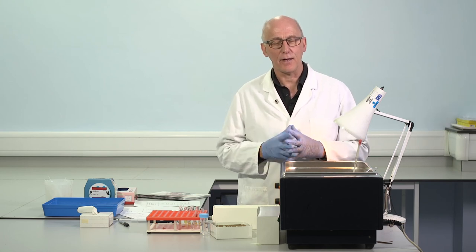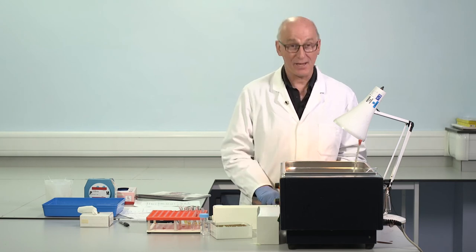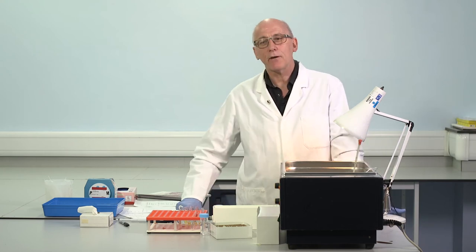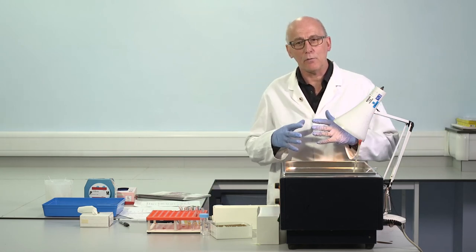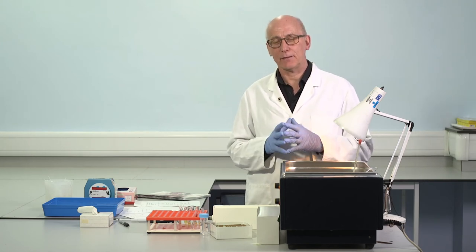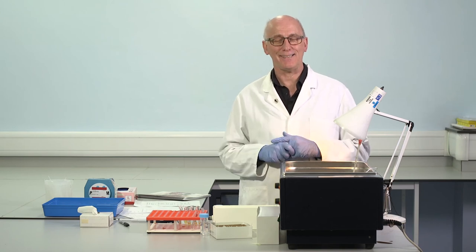And that's a fairly typical finding. So we've got a dilemma in the lab when we are thinking about which APTT reagent to use whilst we're running this correction. If we choose a reagent which has a very high phospholipid concentration, then we will less frequently detect lupus anticoagulant. If we use a very low phospholipid concentration, we will much more frequently detect it.